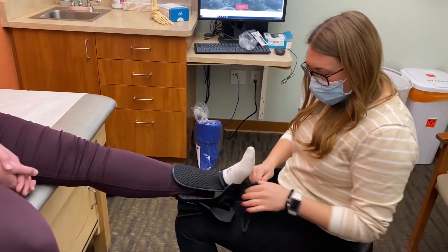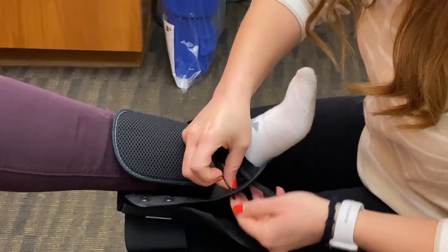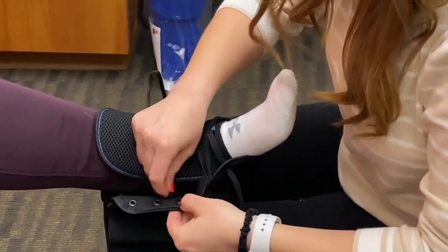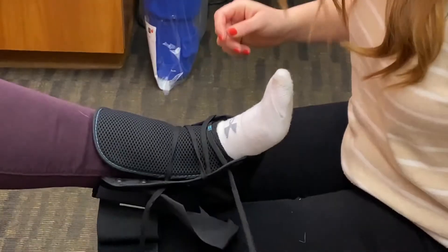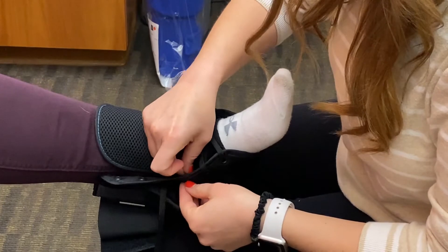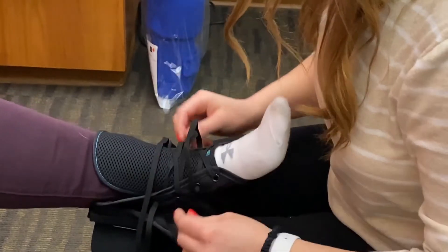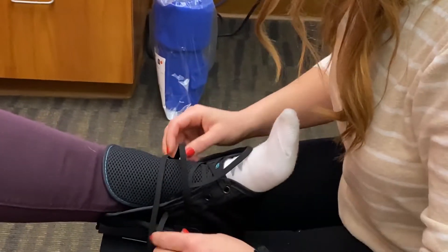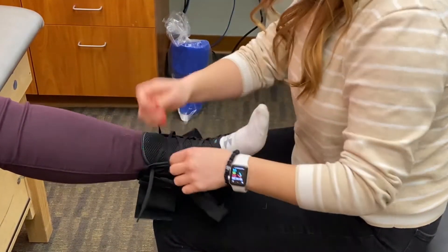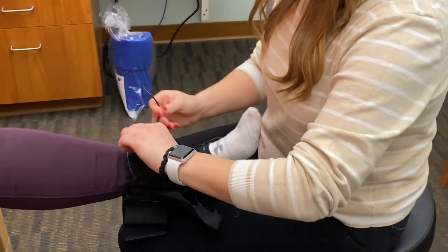Typically with these braces, once they are laced, you don't have to relace them every time you go to take the brace on and off. So lace through the holes — I'll usually do a few to start. Give myself a little tension. Once you get your brace all laced, add additional tightness where necessary, and then tie like a shoe at the top.